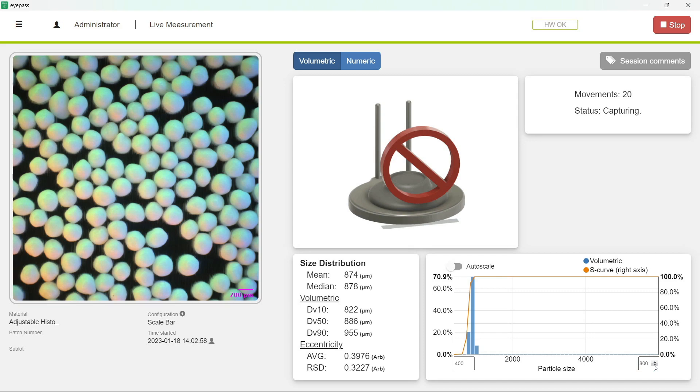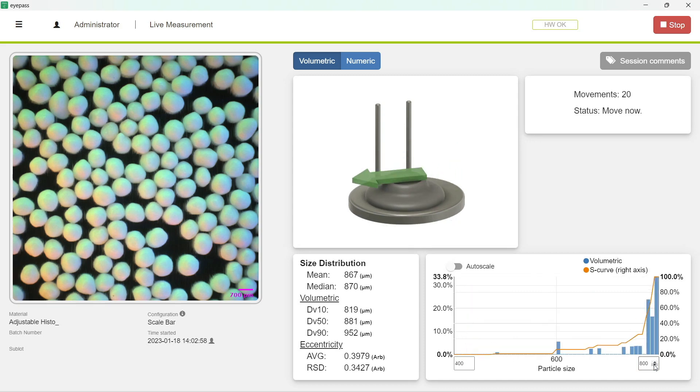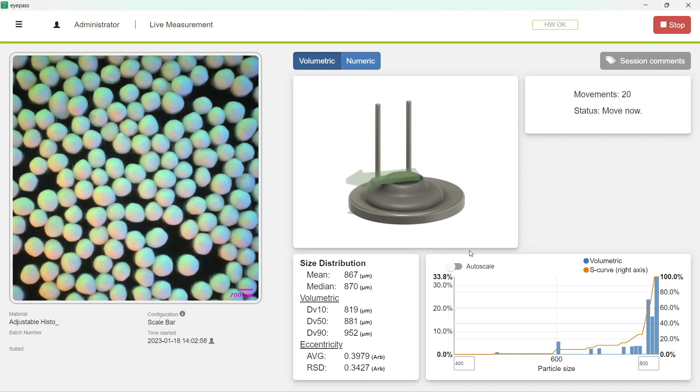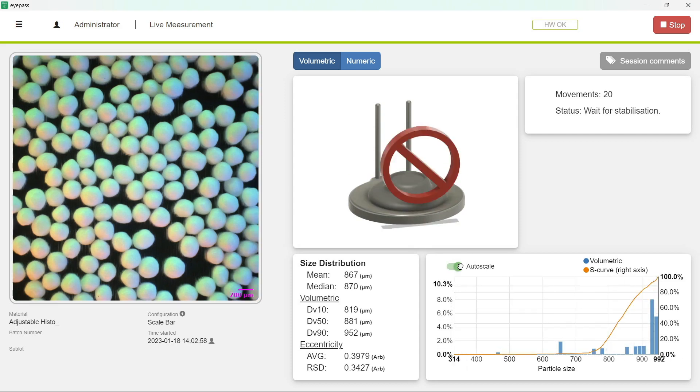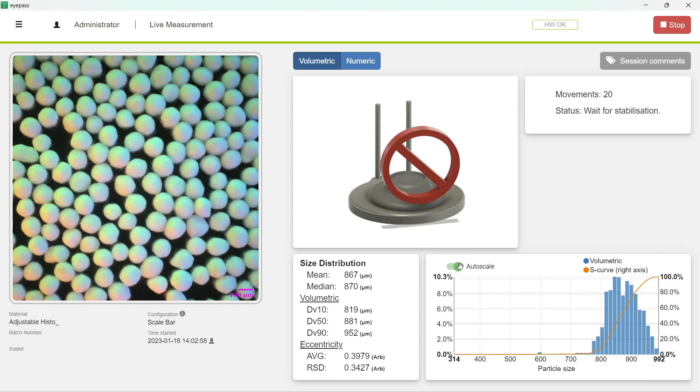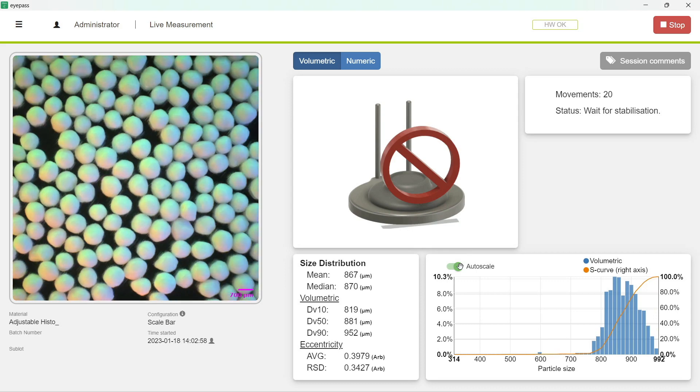So let's just ping it there, and you can see that it has changed. Or you can do it automatically by clicking auto scale, and the S curve as well as the distribution will be changed automatically.